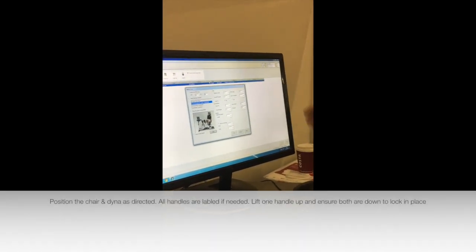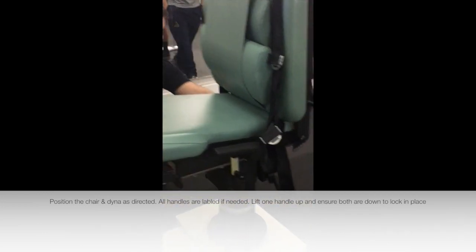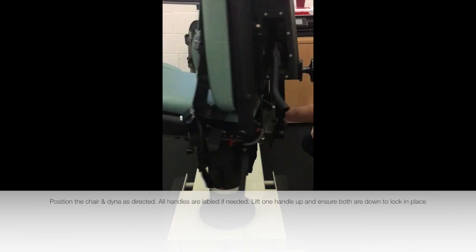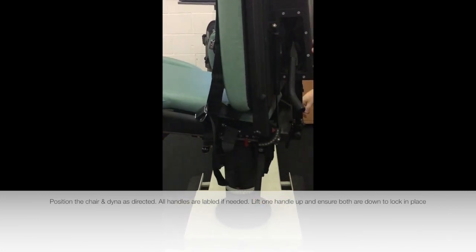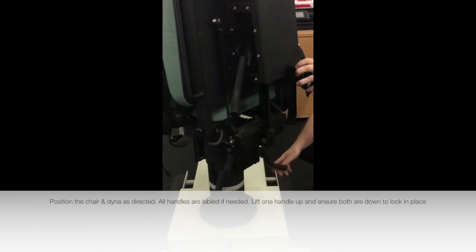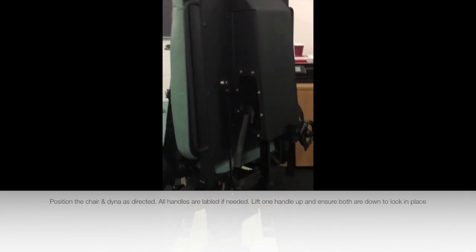So for the chair there, what does it say? Rotation scale 40, green. So there's a lever down here. There's two levers, there's one on each side. If you unlock this one and spin the chair, you can't then lock it through this one. You've got to relock the one that you've unlocked. Move it to where it says green 40, and then just lock it. Happy? So that's the rotation scale.